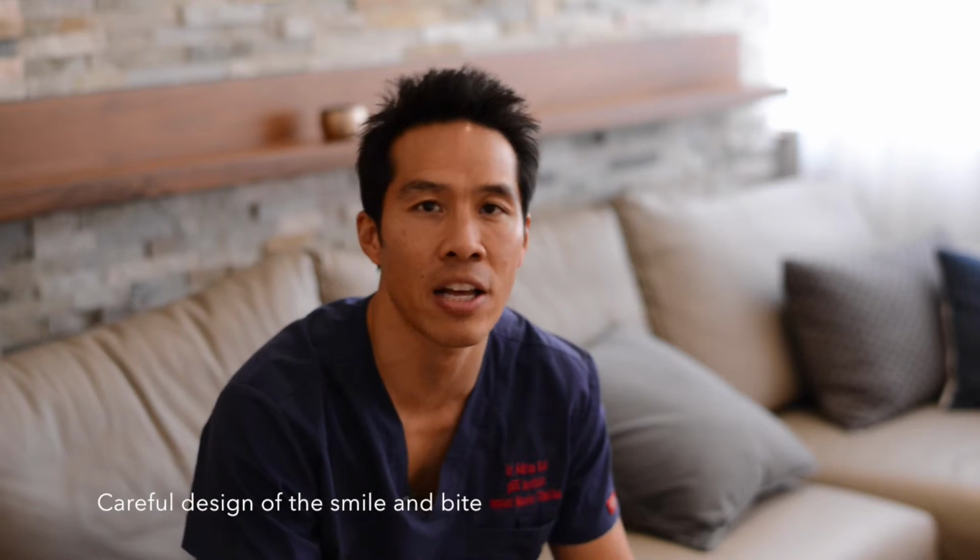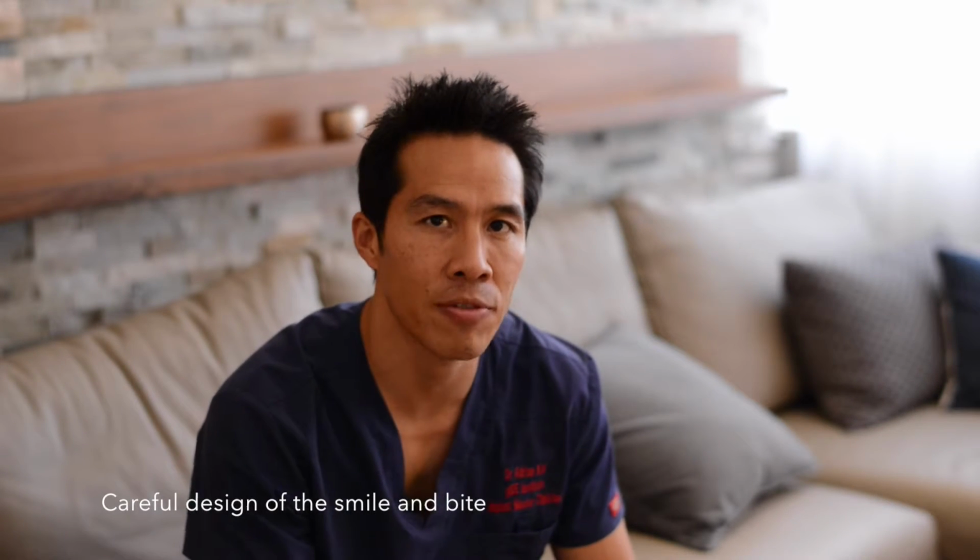We use all of this information to plan exactly where the teeth should go and the smile should be and how the bite should be after treatment. When we've collected all that data on the first diagnostic visit, the second diagnostic visit is to test that. We sometimes need to have maybe a trial denture, or we may need to set up teeth in order to check, are those teeth right for the patient? Do they look right? Does the bite look right? Is there any changes that we need to make before we start doing any surgery?